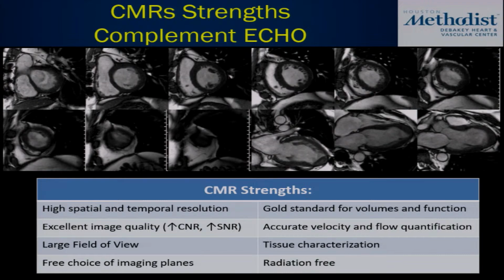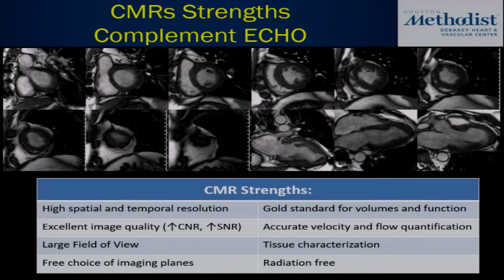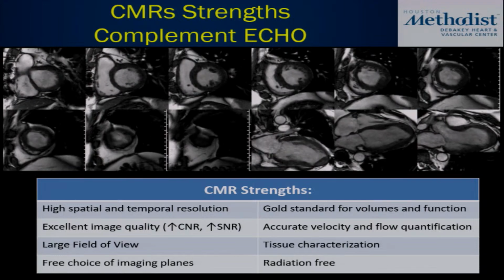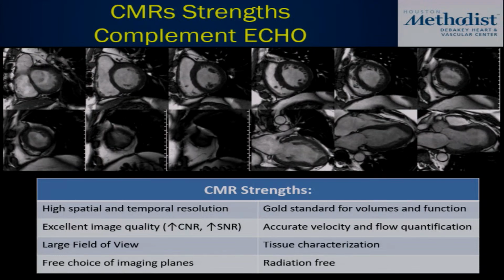So we know all the strengths of CMR. For the sake of time, I'm not going to go over it, but very good spatial and temporal resolution, the opportunity to do excellent tissue characterization, which will allow us to assess the myocardium, and then, of course, the ability to do flows, just like echo.